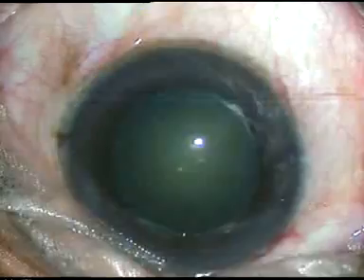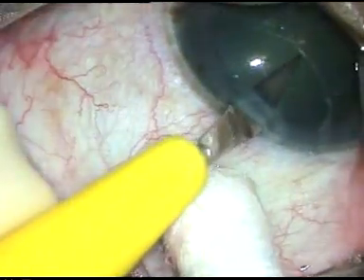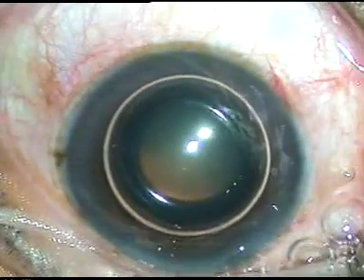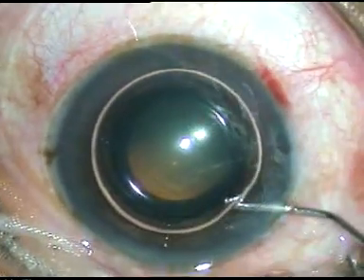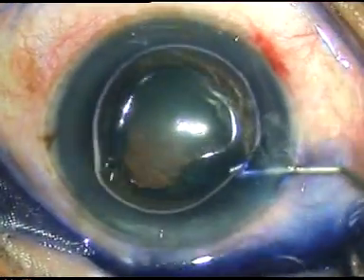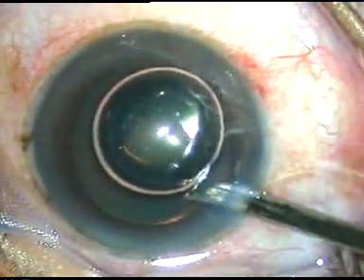This is another side port on the left side of the incision. All the incisions are complete and there is no leakage of aqueous humor. This has been possible because when you come out, you just don't depress the posterior lip of the incision — just lift the instrument and come out, and there will be no leakage of aqueous humor.